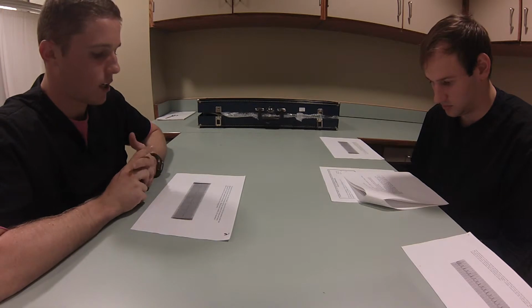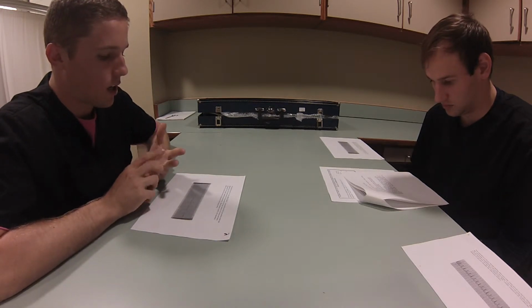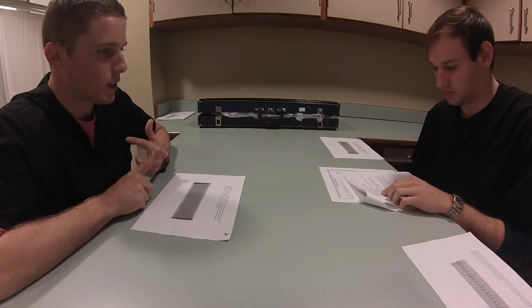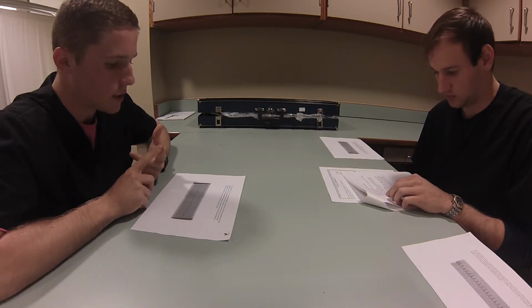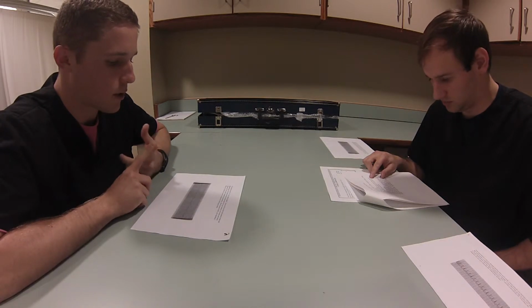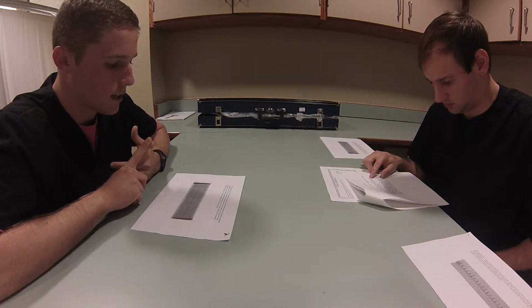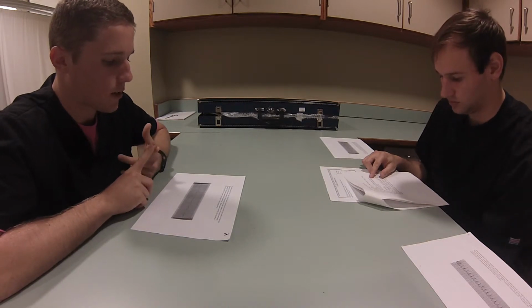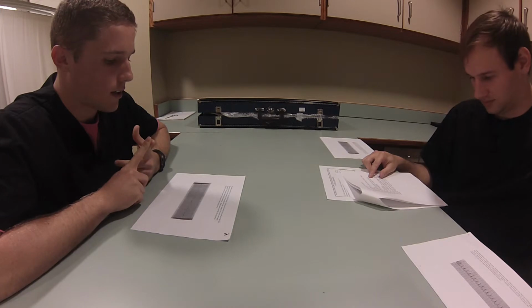Okay, I'm going to put my patient on the monitor. I'm going to go ahead and apply oxygen, 15 liters a minute, non-rebreather. I'm going to go ahead and establish an IV. Since my patient is unstable with 84/60 blood pressure, I'm going to go straight to transcutaneous pacing. I'm going to set the rate to 80 and make sure I have mechanical capture. After that, I'm going to transport.